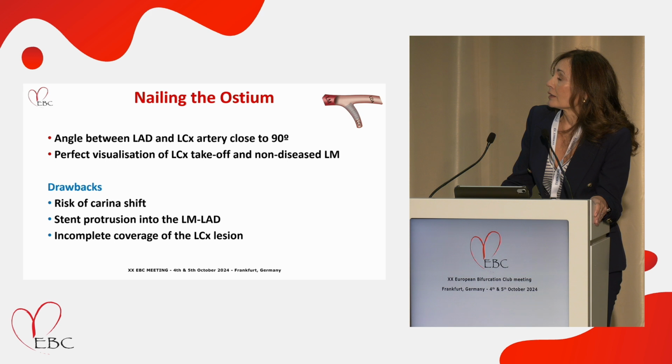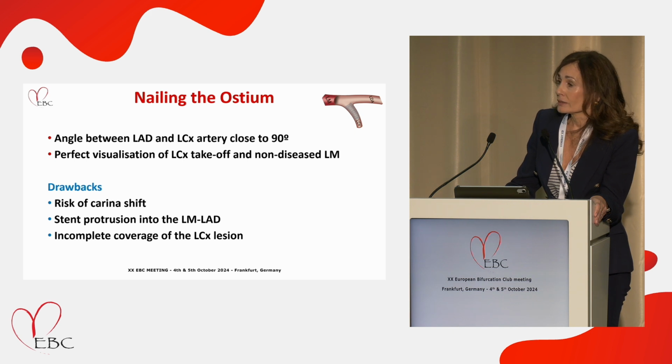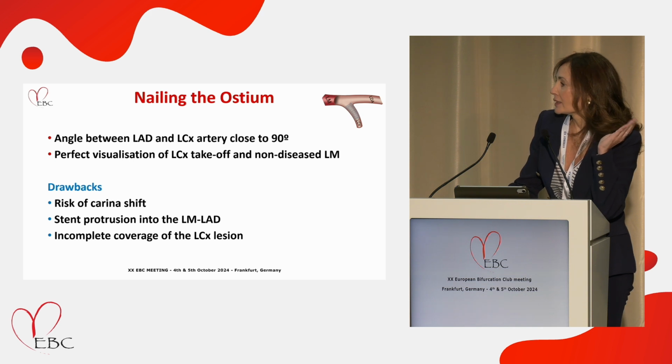This technique obviously has some drawbacks. There is a risk of carina shifting. Stent protrusion into left main and LAD is frequent, or incomplete cover of the circ ostial lesion, because a perfect angle and precise deployment really are not easy.